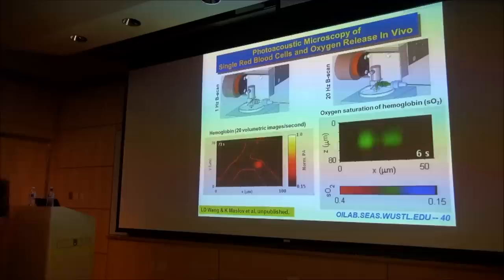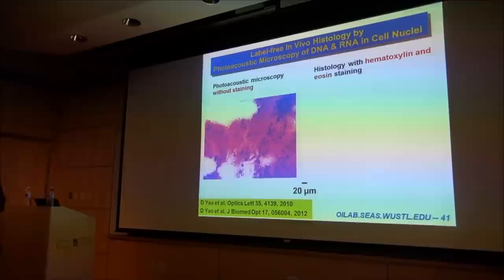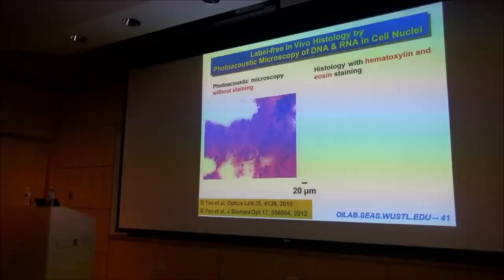You can't go down to the hemoglobin level, right? Because you have to have a carrier to watch the oxygen release. And you can see those red blood cells stuck right here. Don't worry, eventually they'll go through. You've got to wait long enough to see that happen. It's pushing your patience, right? Anyway.